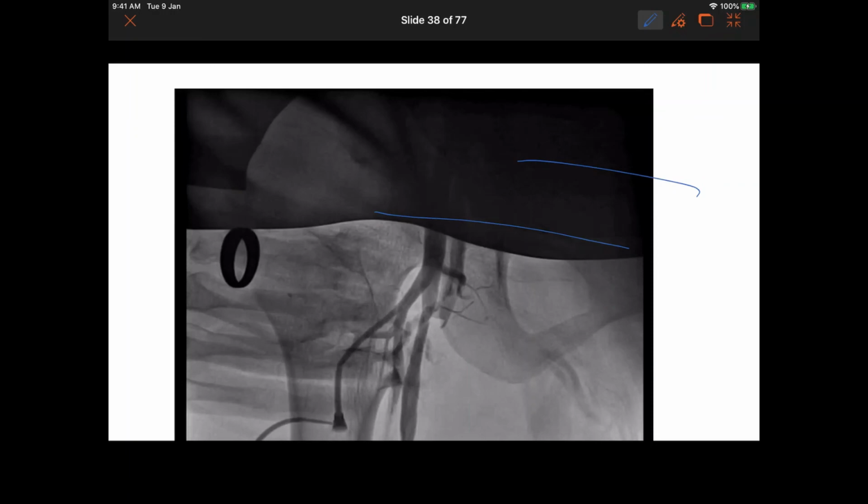After the procedure and the removal of the Inoue balloon, what was noted was a spurting of blood from the venous side. It was quite obvious this was not venous flow. It was definitely arterial and it was coming from the venous side.